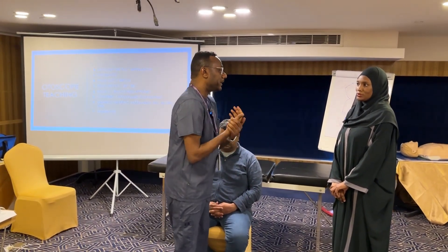Hi, my name is Mohamed, one of the ED doctors. Can I confirm your name please? My name is Zainab, one of the junior doctors. Hi Zainab, nice to meet you. Nice to meet you. How can I help you today? I want to learn about the otoscope, the procedure. And how much do you know about otoscope use? Unfortunately, I know nothing about it.